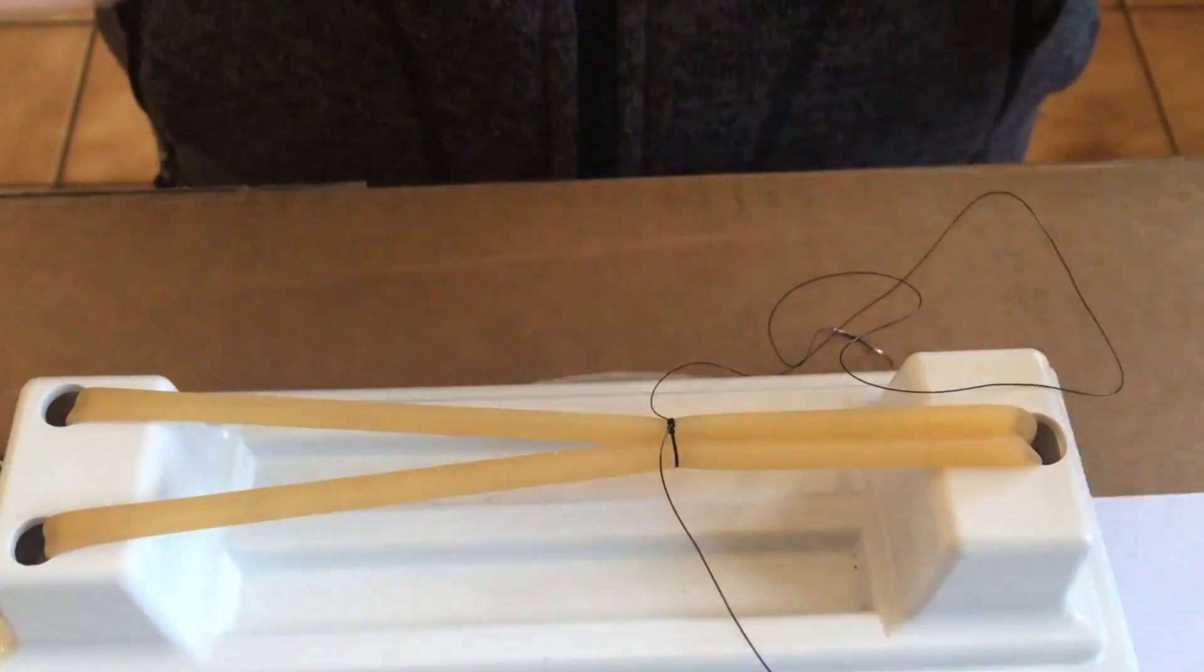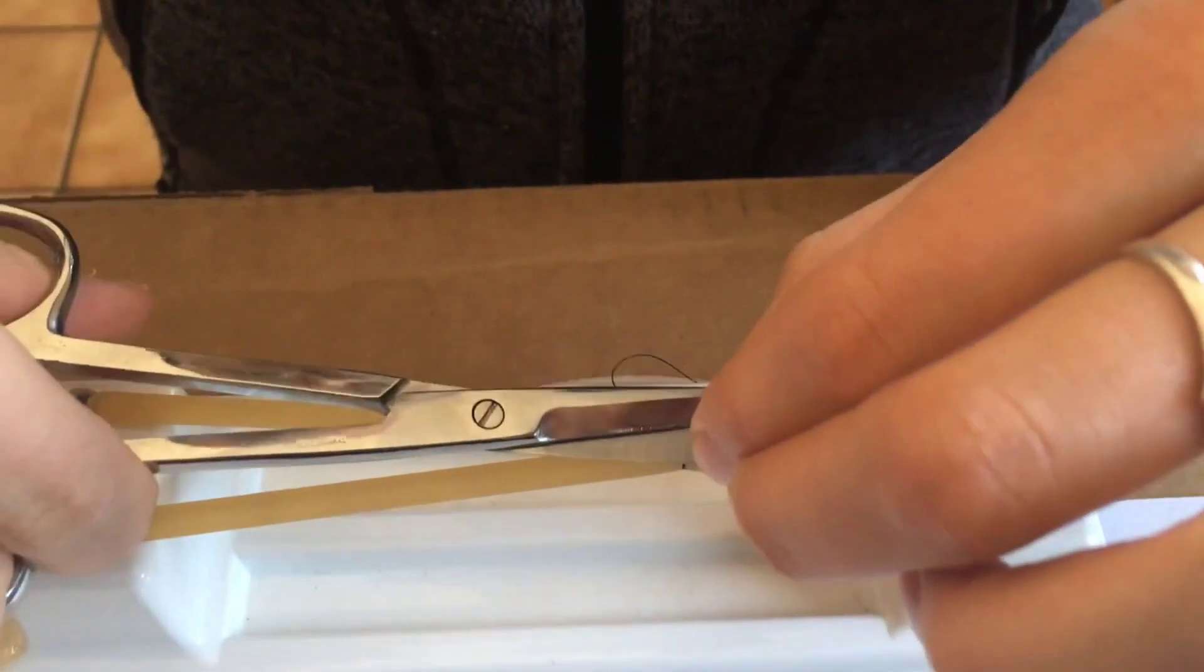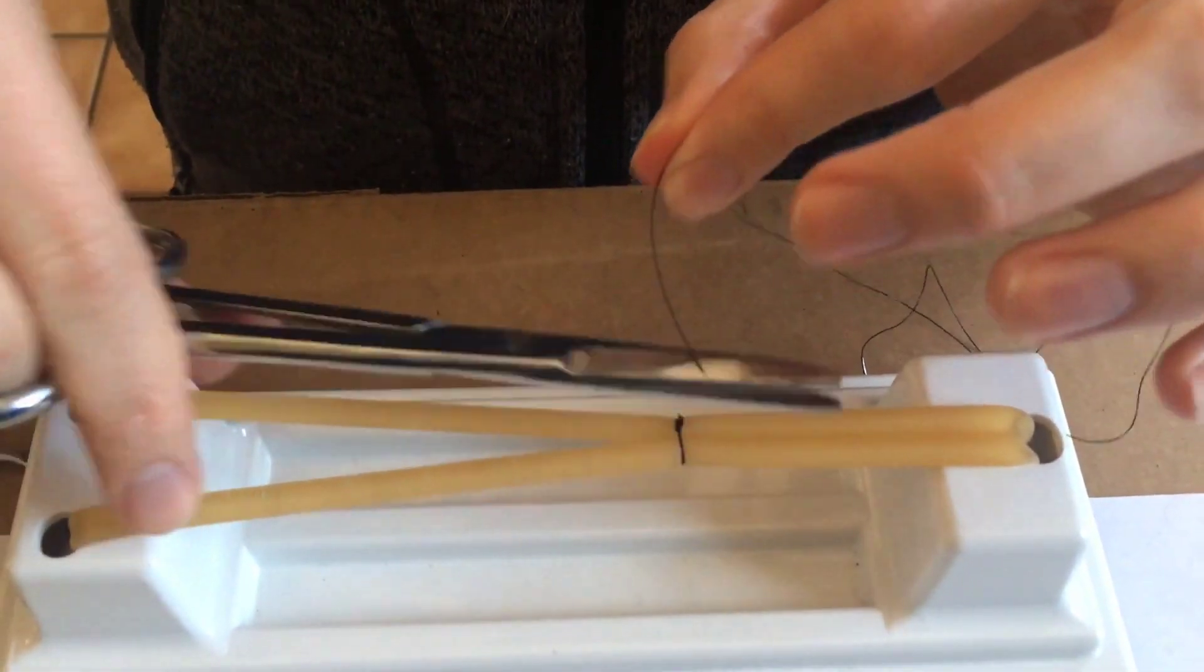Then cut off the tail and the rest of your suture.